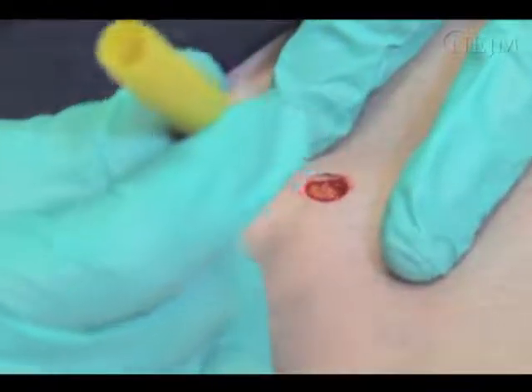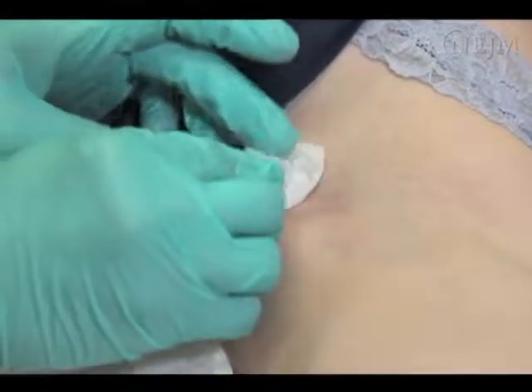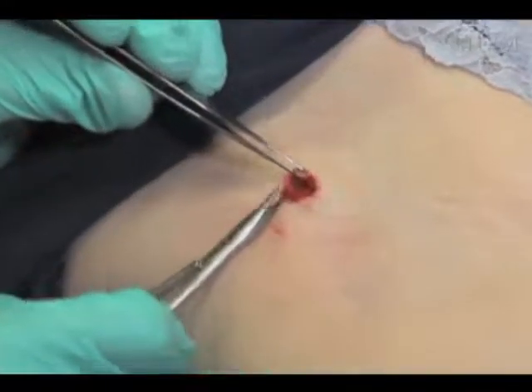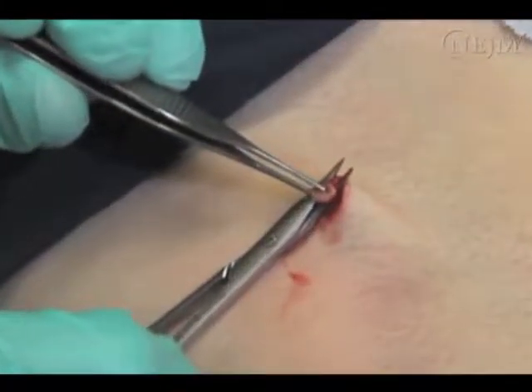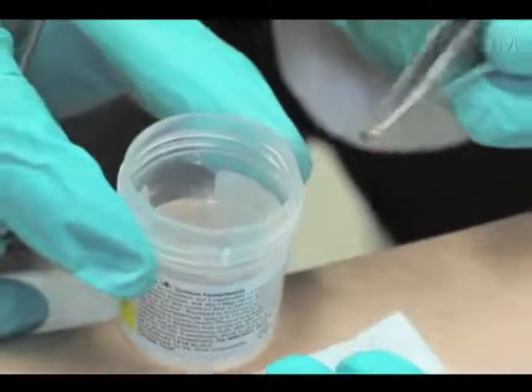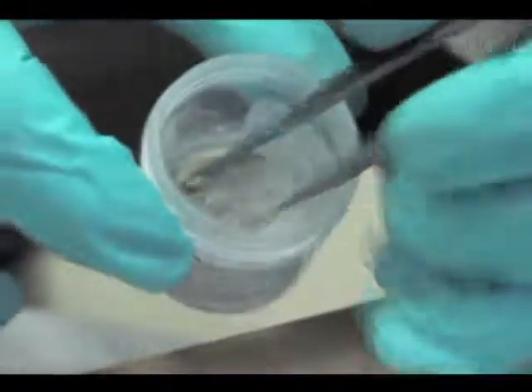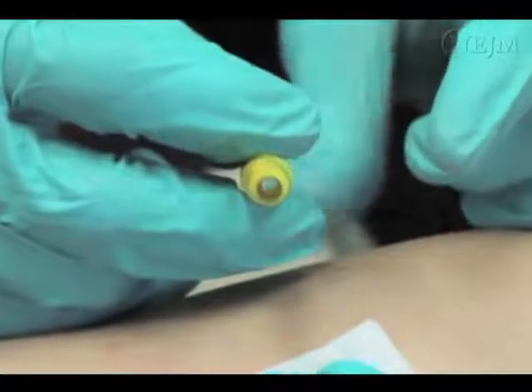Withdraw the punch. At this point, bleeding may occur and require blotting with gauze. With toothed forceps, carefully grasp and lift the specimen, taking special care not to crush it. Use scissors to cut out the base of the specimen at the level of the fat. Place the specimen in a labeled bottle containing the appropriate reagent — here, formalin. Check the punch instrument to be sure no tissue remains; a good rule of thumb is to be able to see through the entire hollow tube.